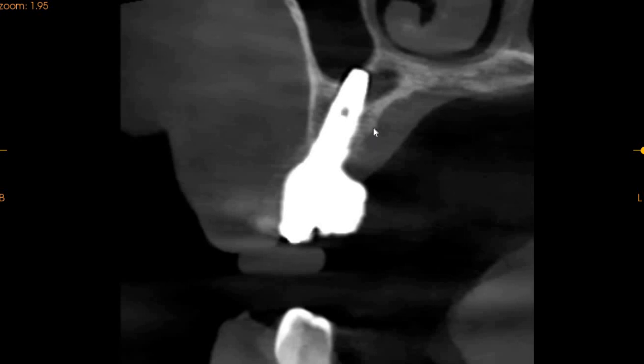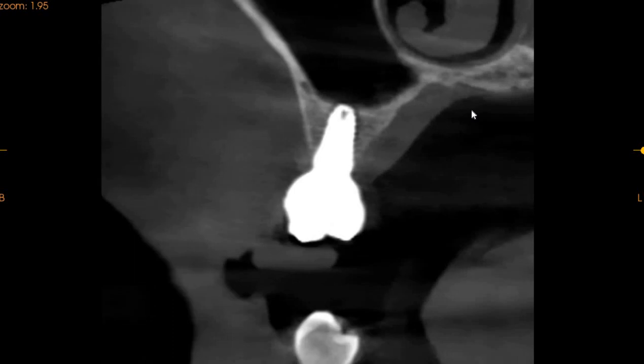The implant is placed very well in the center of the ridge. Moving to the distal aspect, this is the implant in the 5 region — absolutely center of the ridge. No radiolucency, no sinusitis can be seen.